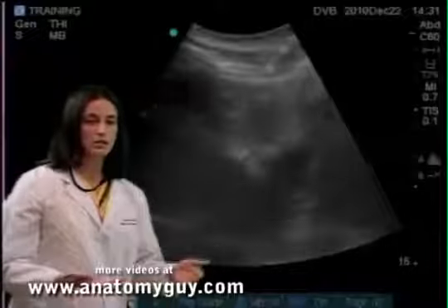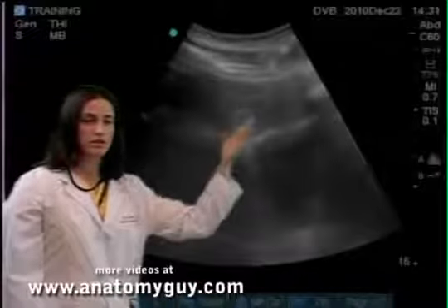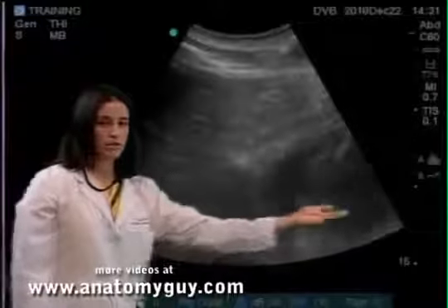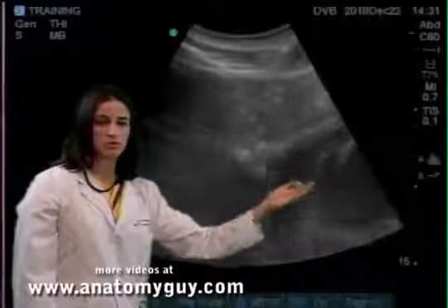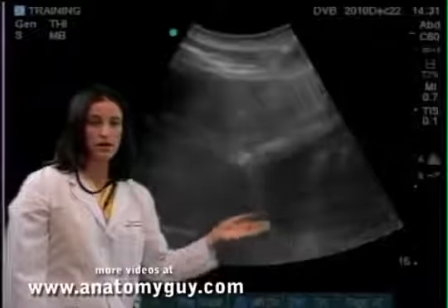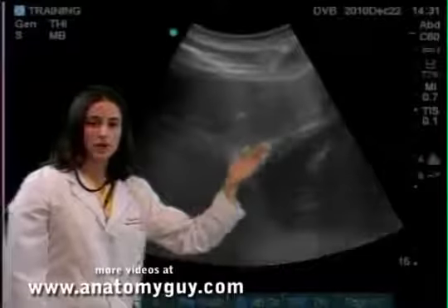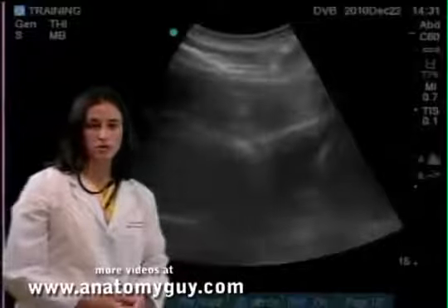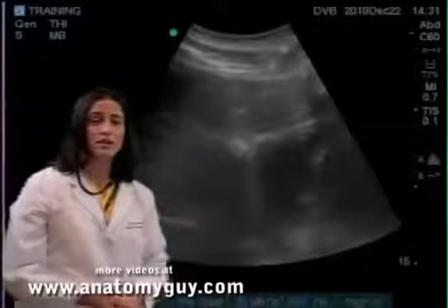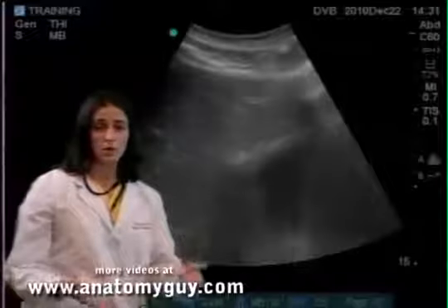To point out the clinical anatomy that we see here, we are using the liver as an acoustic window. We see, first, the right ventricle, the left ventricle, and the septum. This is a normal beating heart that is not hyperdynamic. There is no hypoechoic stripe or black line indicating a pericardial effusion. This is unlikely cardiogenic shock. The patient is not tachycardic here, and there is nothing indicating a pericardial effusion.